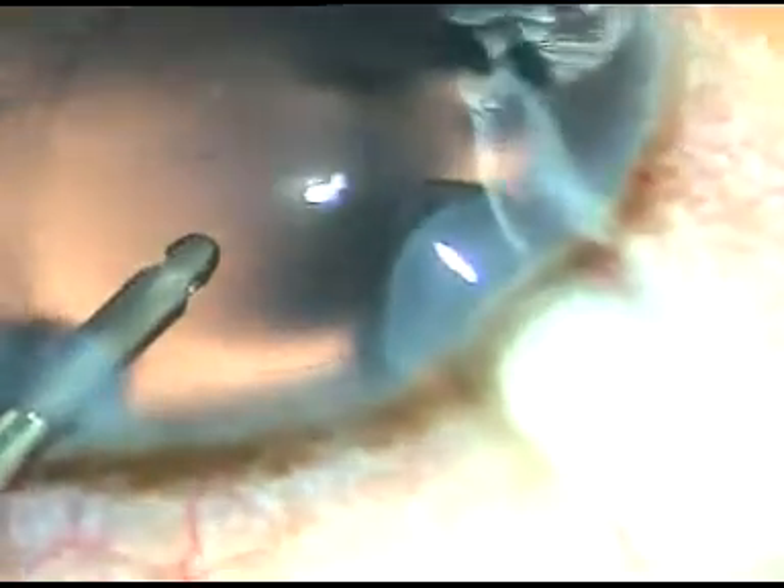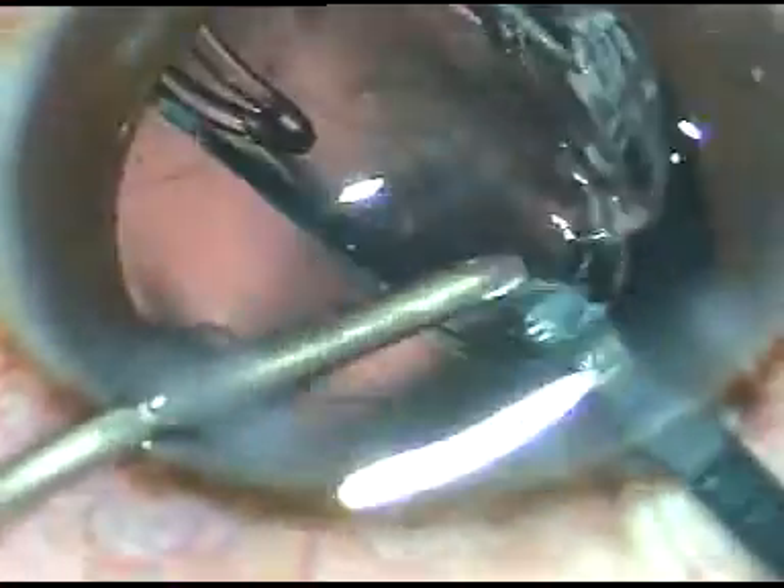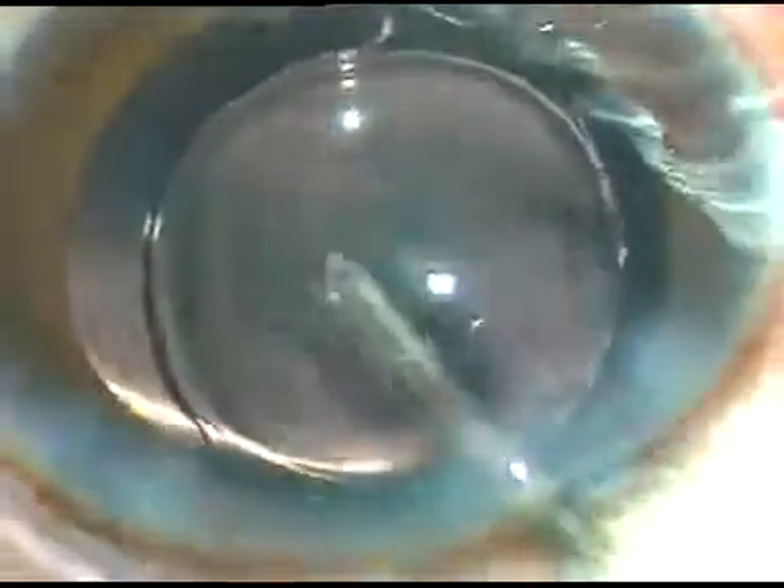This is a hydrophilic acrylic intraocular lens being implanted under irrigation. When we implant under irrigation we save a lot of time — we don't have to spend time to remove the viscoelastic substance. Whatever little viscoelastic substance is there in the lumen of the cartridge comes out very easily just by irrigation while dialing the lens.